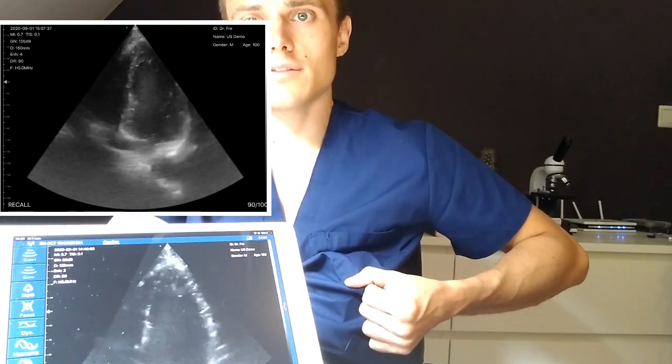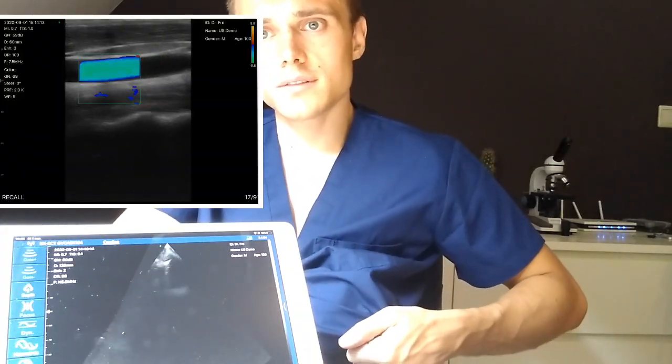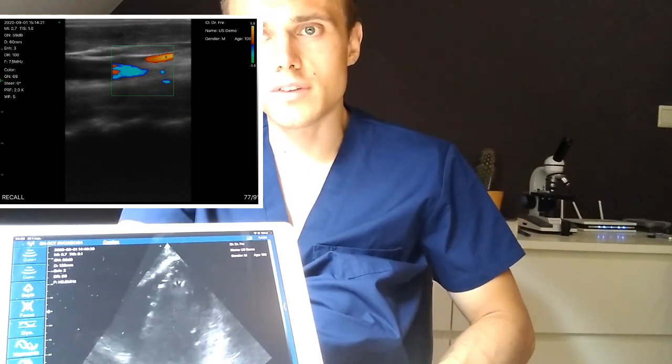And now you can go to the apical view. Again, you can definitely see the valve leaflets opening and shutting, you can see the left ventricle, the right ventricle. Save more clips. So this technology really allows you to assess rapidly the function of the heart.